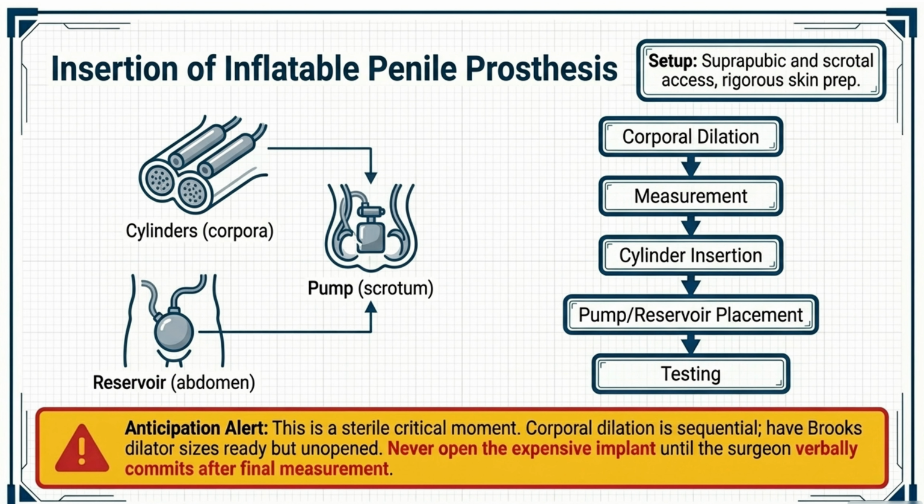This slide highlights safety alerts and critical thinking in GU procedures. Awareness of high-risk moments helps prevent complications. Communication with the surgical team is essential. Preparation and vigilance ensure smooth operations.